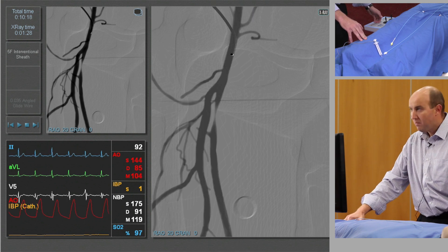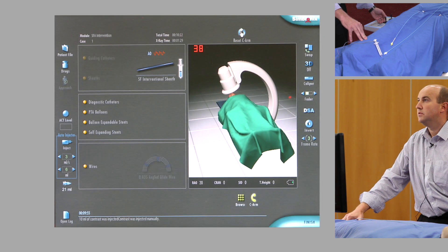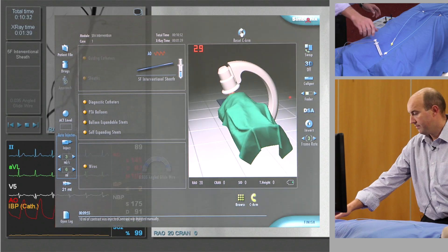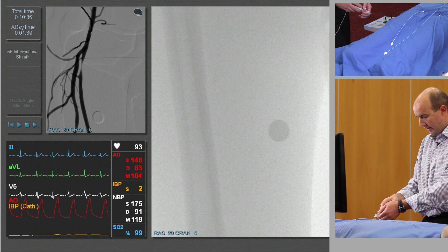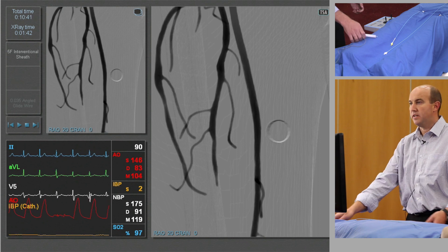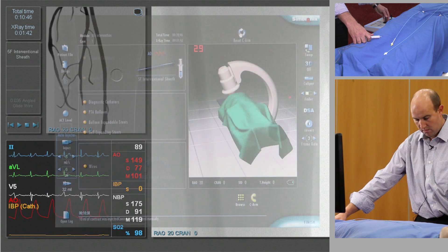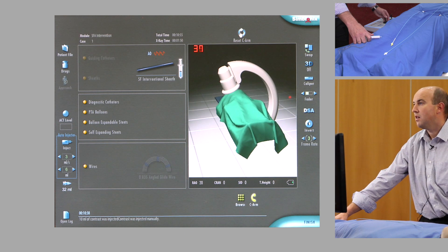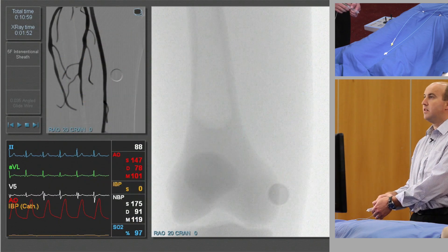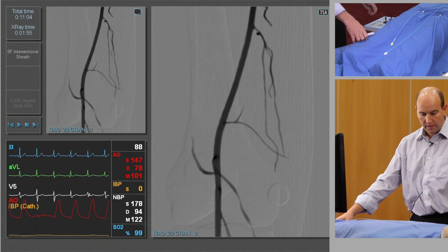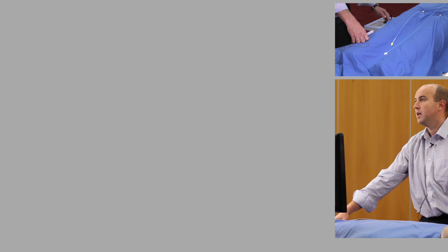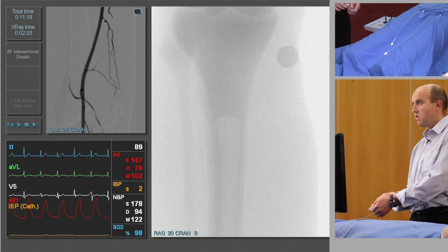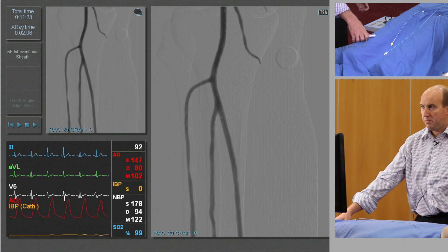We'll now go on and do a full diagnostic run of the leg, which will entail going down to mid-thigh. We'll leave the oblique on for now — there's no distal SFA disease to see. Moving to the knee joint and doing another DSA run — the popliteal looks very clean. The popliteal is spared with three good vessels.